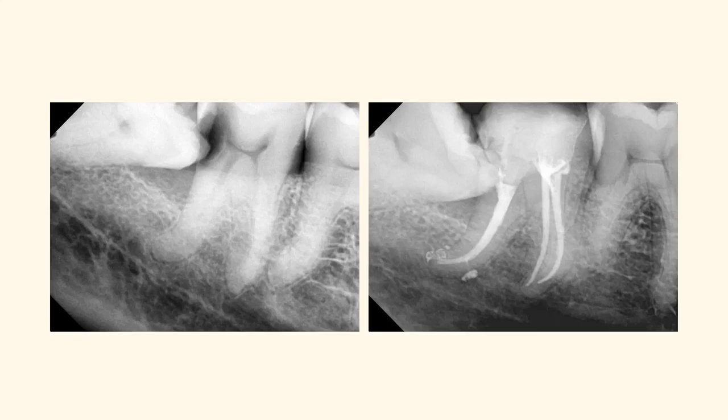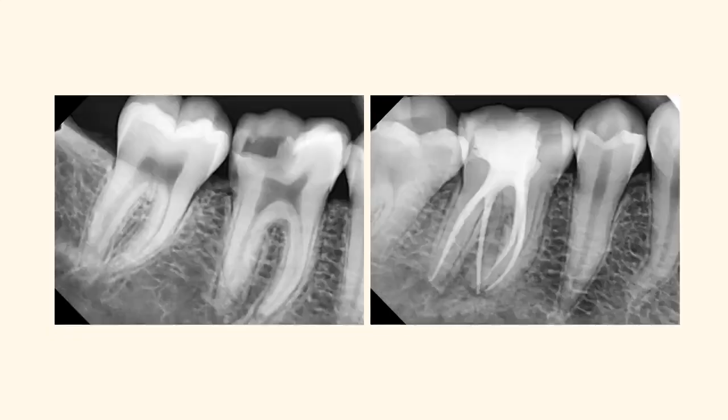Always remember that every root canal has some form of curvature. Many of them have a tendency to curve and ramify in the apical portion. And apical pulp tissue is more fibrous due to the presence of more collagen fibers at the portal of exit where the pulp and periodontal ligament meet. So maximum care should be taken during negotiation of the apical third of the canal to avoid mishaps. Another case with proper instrumentation resulting in a proper glide path.